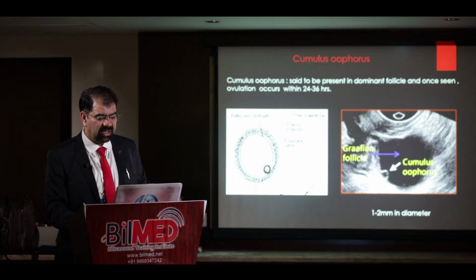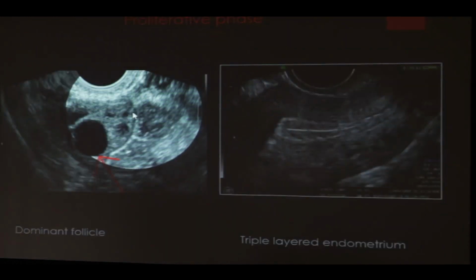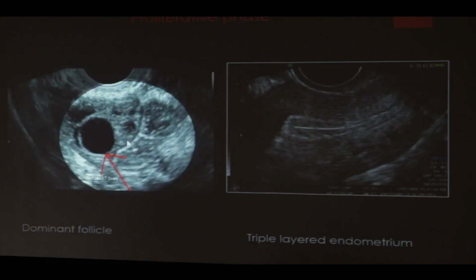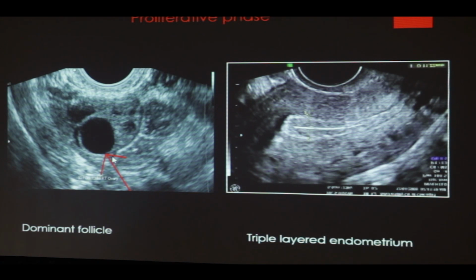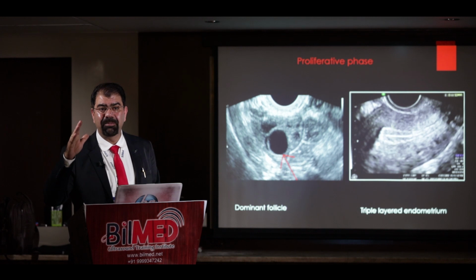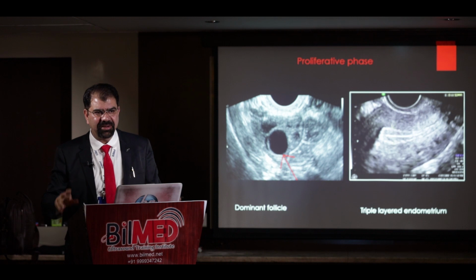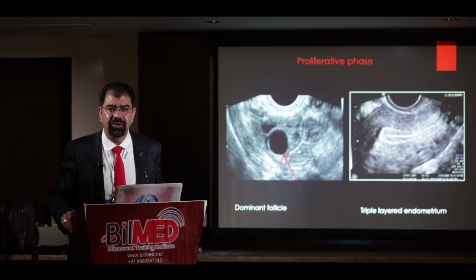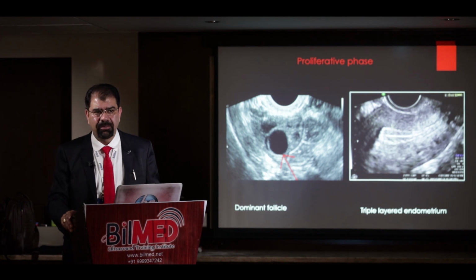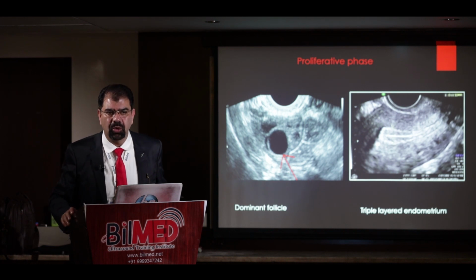Now, the first thing is that usually I am having some follicles in this ovary, but when a dominant follicle can be seen, it will usually be more than 12 mm. But in a baseline scan, for example, I am scanning at day 3, at times I may not comment which is the dominant follicle, but if a follicle will grow, it will have its growth rate.